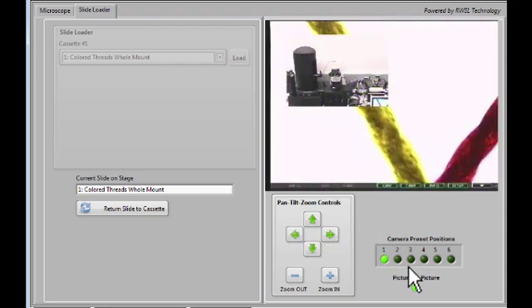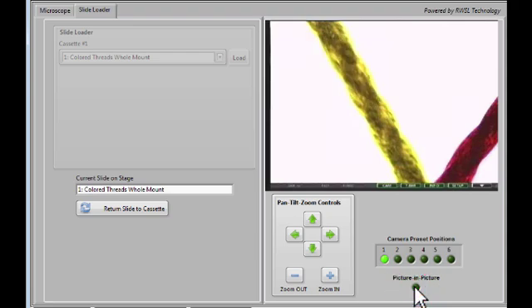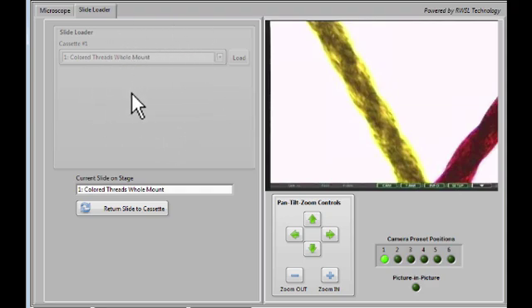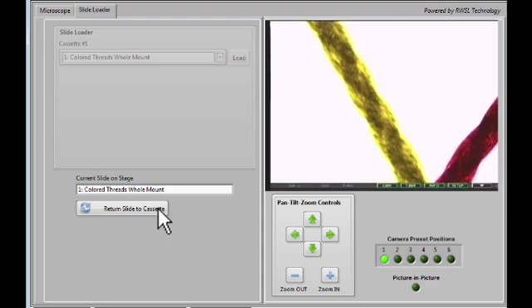Now we see a slide has been loaded onto the stage, and we also notice that the cassette controls have been grayed out. Until you return the slide to the cassette, you will not be able to select another slide.